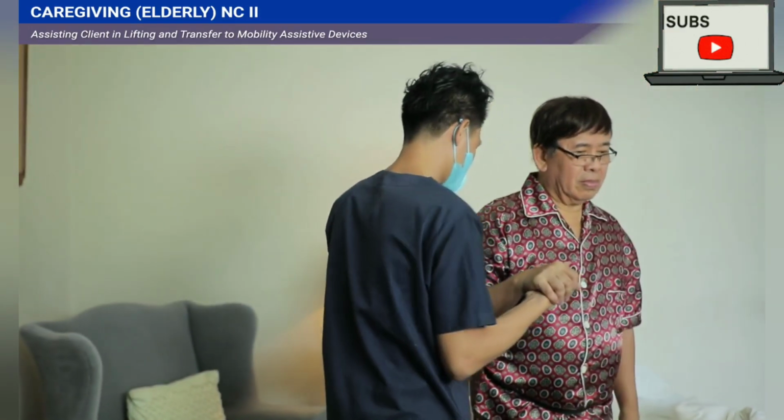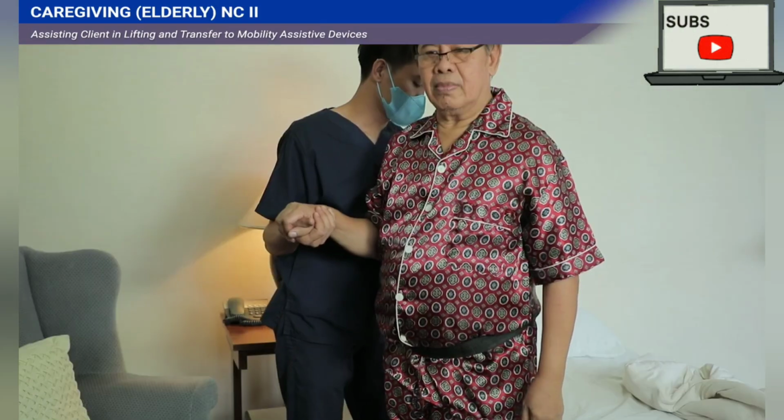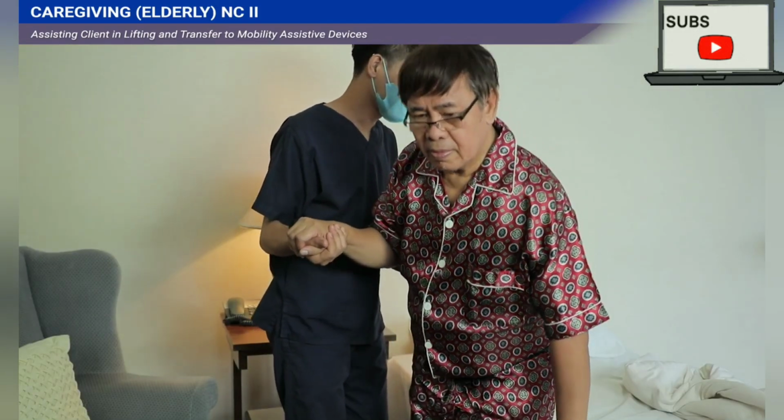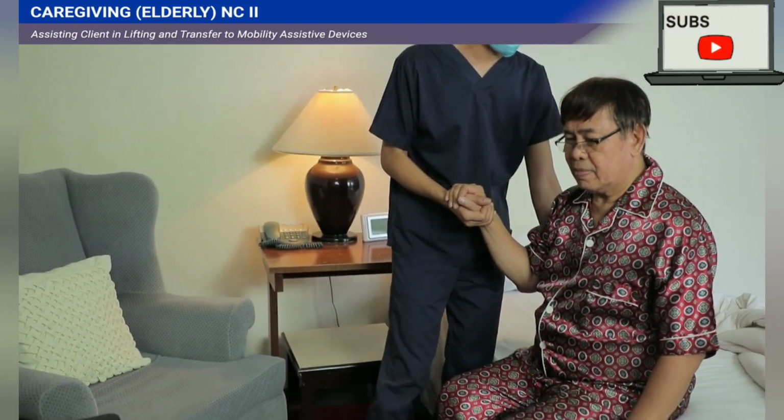Help the client sit down. Ask the client to reach for the bed, bend the knees, and keep the shoulders forward.